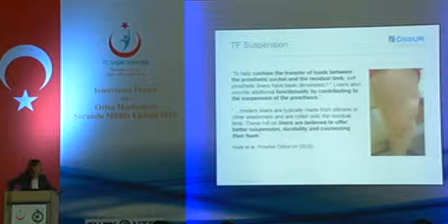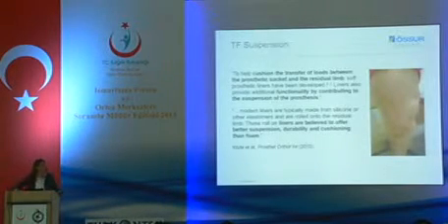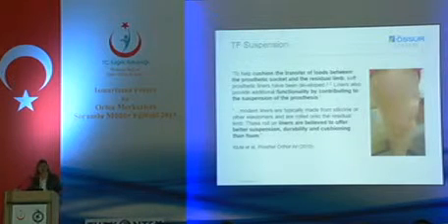And they offer better suspension, durability and cushioning than something like a foam type liner.